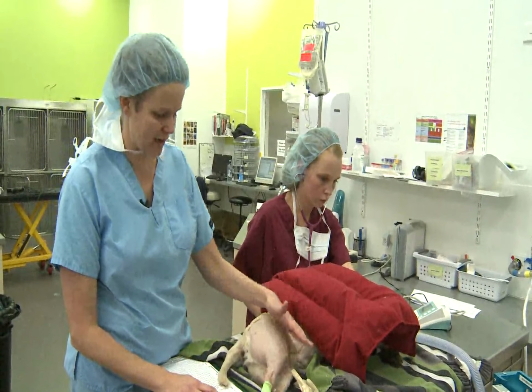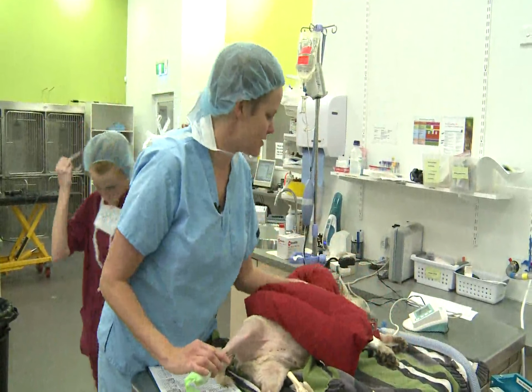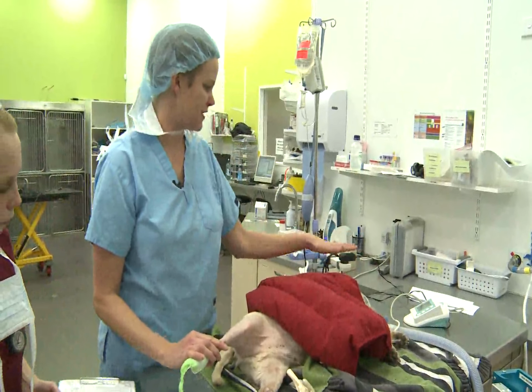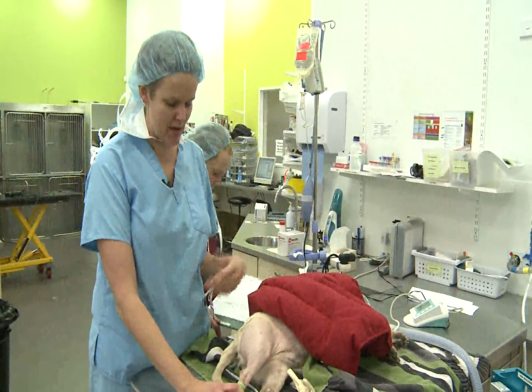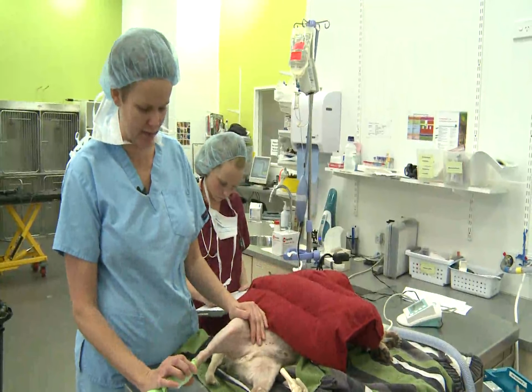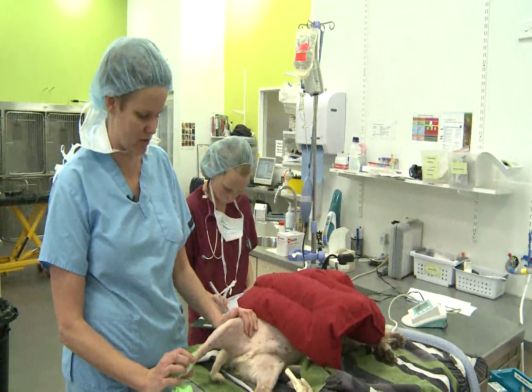So wee Clyde's leg is all prepped up, sterile. He's anaesthetised. He's hooked up to his anaesthetic machine. He's got a warm air blanket on, and we're monitoring his blood pressure, and he's having fluids and painkillers through his drip. His wee knee has had all the hair clipped off so that we can reduce the chance of him catching an infection from his skin bacteria during surgery.